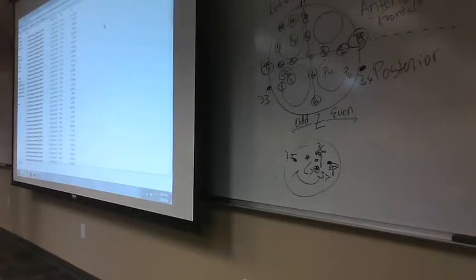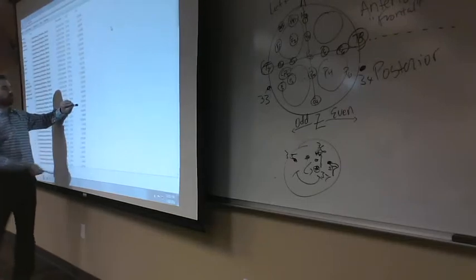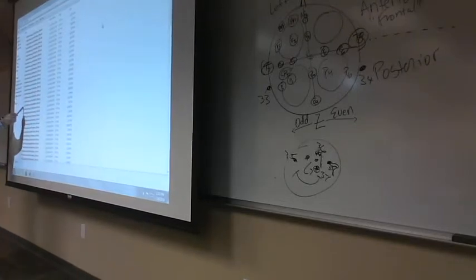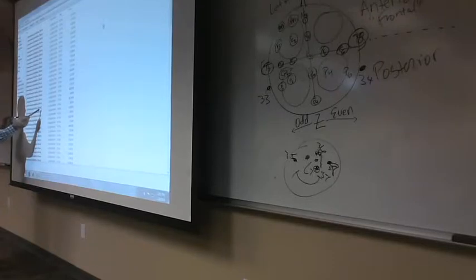Now remember we said that EEG Lab gives us 2 files for each subject, right? There's basically a big file and a small file. So for example, let's talk about subject 12 right here. Come all the way out here to our file size. We see a very large file and then a very small file. They both have the same name. They just have a different file extension. So you have an FDT and a set.